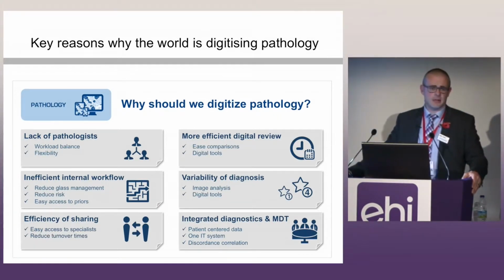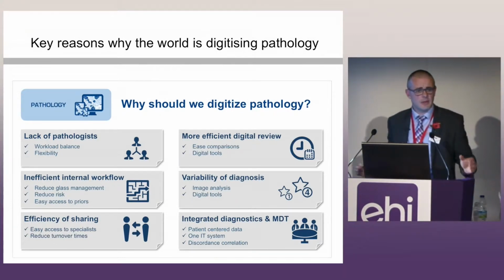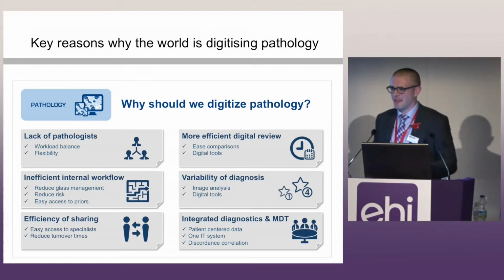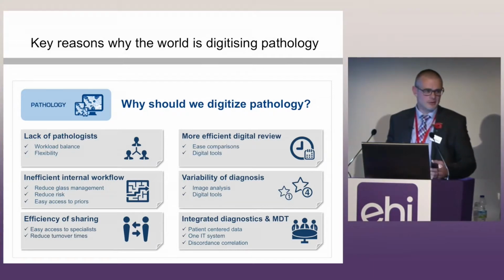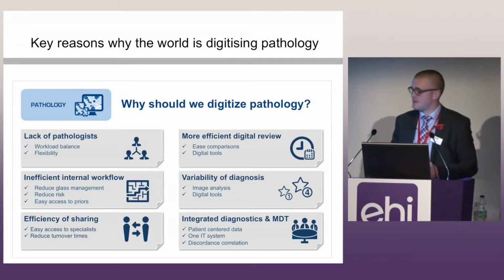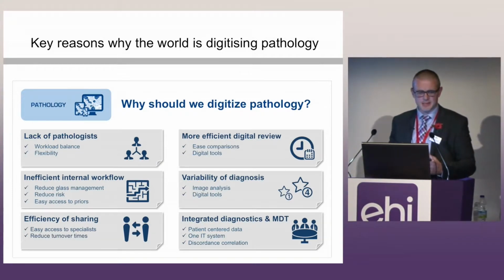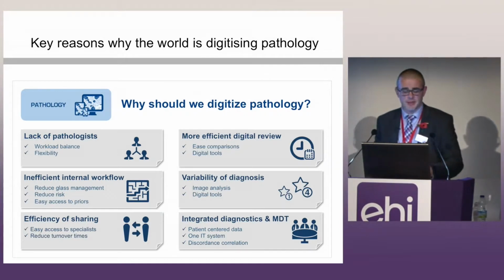We've already talked about the inefficient internal workflows associated with moving these glass slides around. Back in the day, radiology films used to get left in orthopods' cars or go home with a radiologist for reporting. Pathologists see the same issues today. So really, digitising this workflow means that lost images and misplaced studies are a thing of the past.